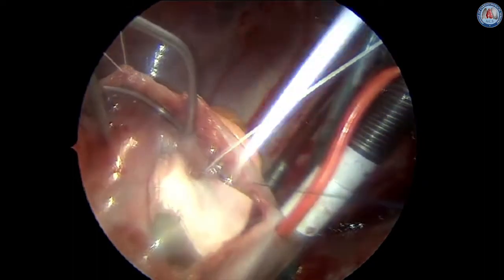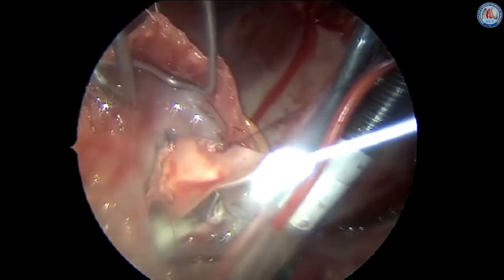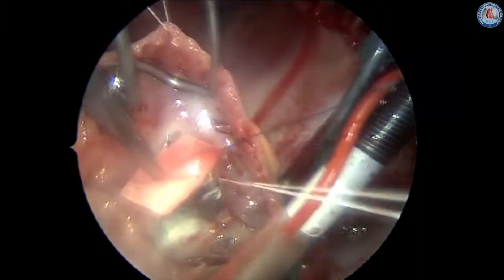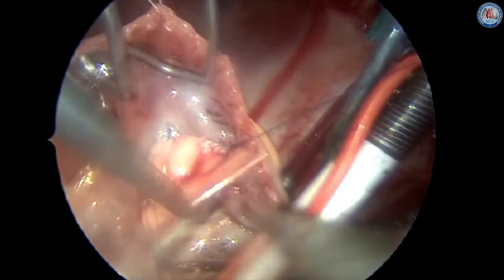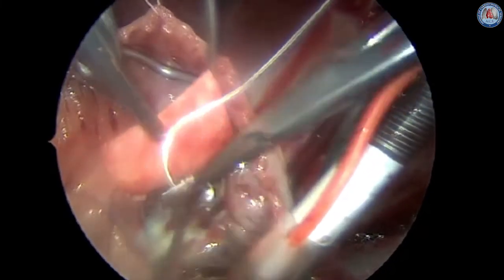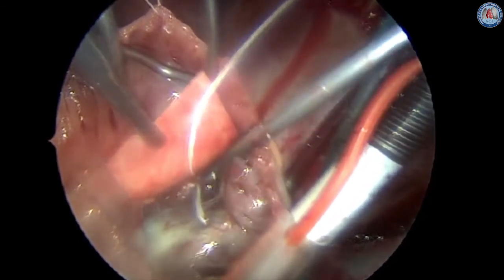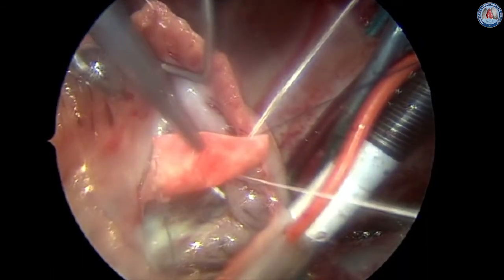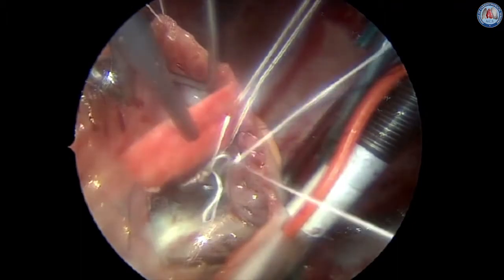After fixing the base of the loop set to the papillary muscle, every single loop is then attached with a PTFE suture to the pericardial patch, paying special attention not to pass the fixing suture of the loop near the free edge of the patch, but leaving enough distance between the insertion site of the loop and the free edge of the patch, as this increases coaptation surface. This is possible because the morphological configuration of the right ventricle does not permit right ventricular outflow tract obstruction. Every single loop is separately fixed to the pericardial patch and then tied.